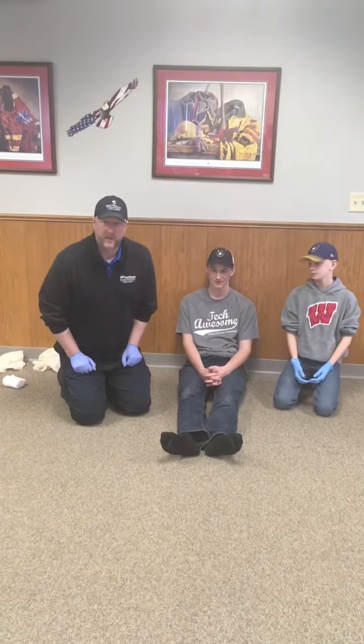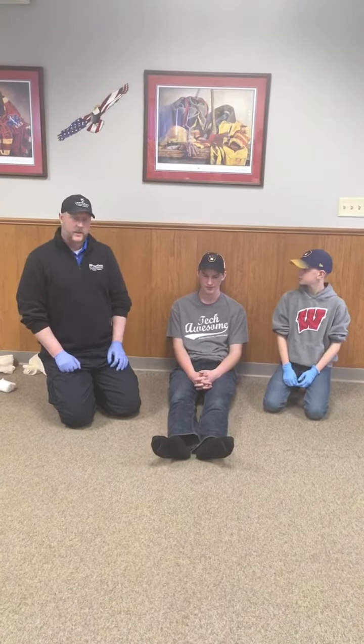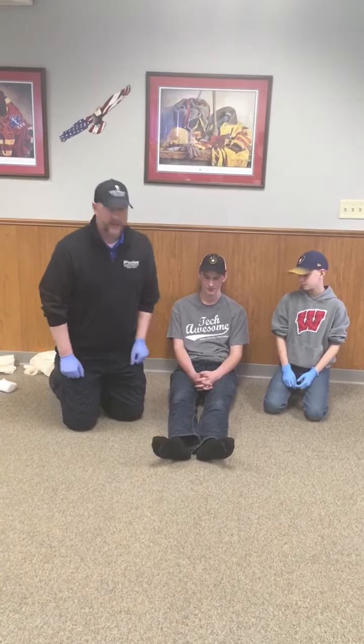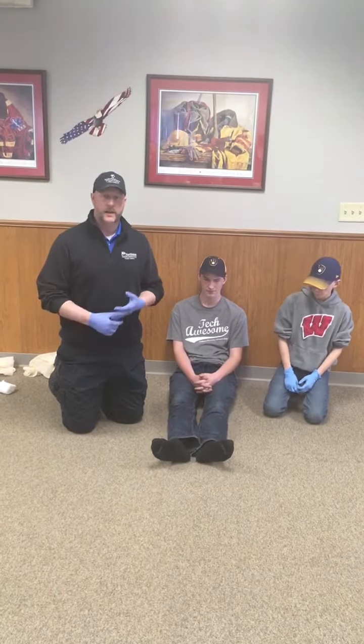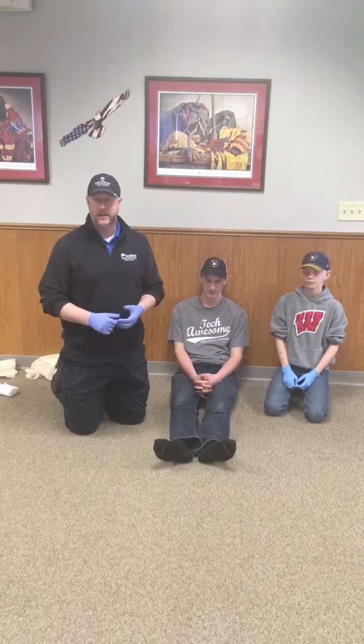We're going to go ahead and splint a leg injury of the tibia or fibula. When looking at a lower leg injury, with all splints we need to splint the bone and the joint above and below, so we're going to need to immobilize the ankle and the knee.